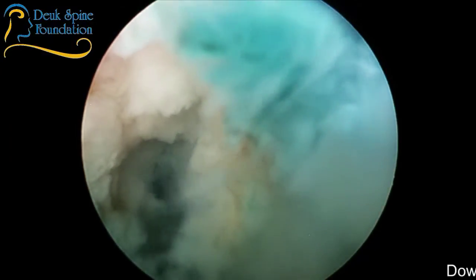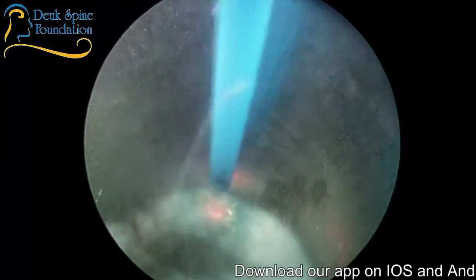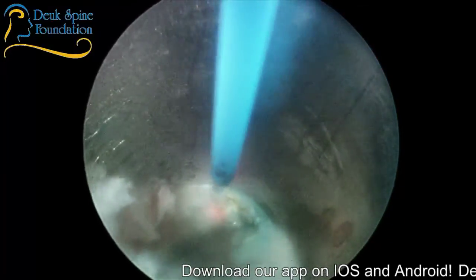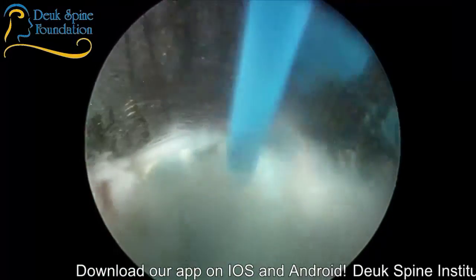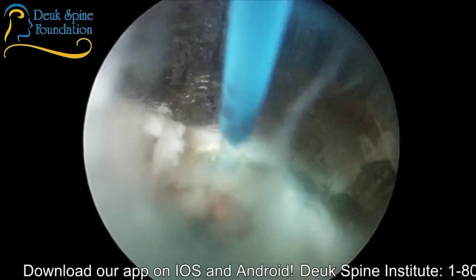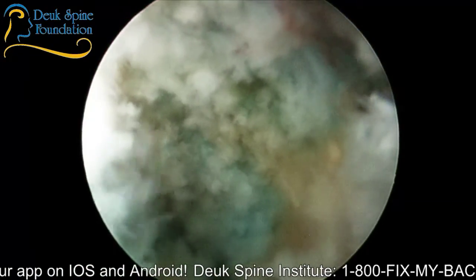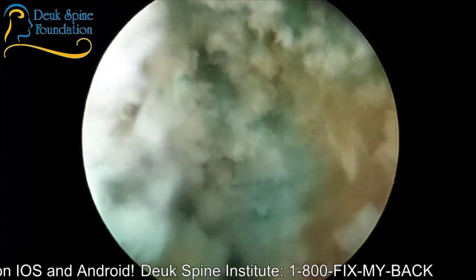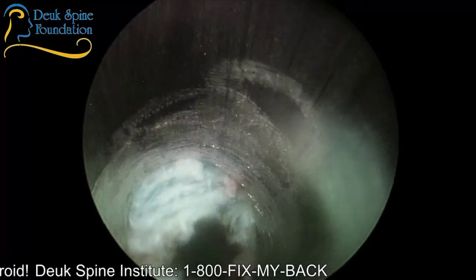Let me get that one last piece right there. We're pretty much done here. So you can see from the surgery that I did clean up the annular tear, but there's a hole there, and really any heavy lifting, bending, twisting, or any kind of force on the disc would push out another piece quite easily. So patients have to be really careful after the surgery to make sure that they don't overdo it until they're healed all the way.